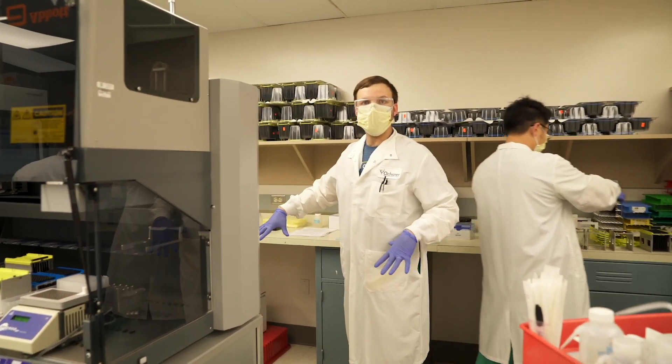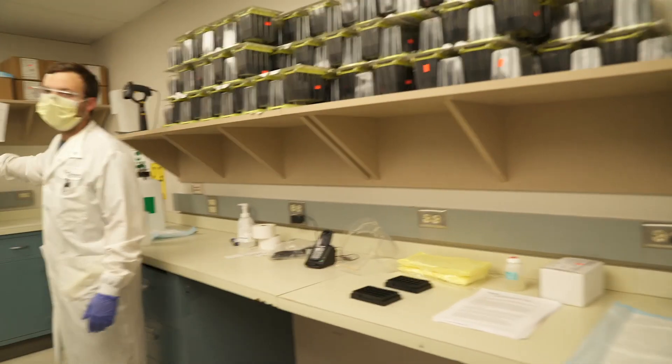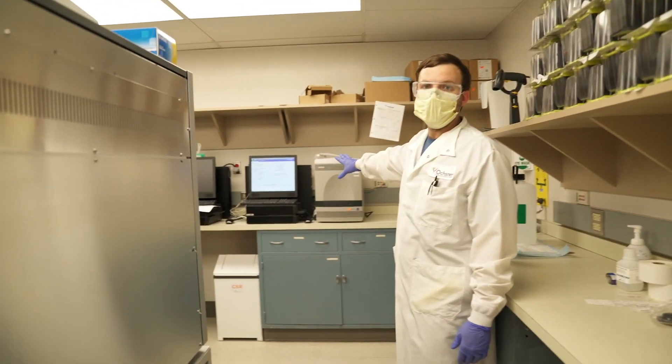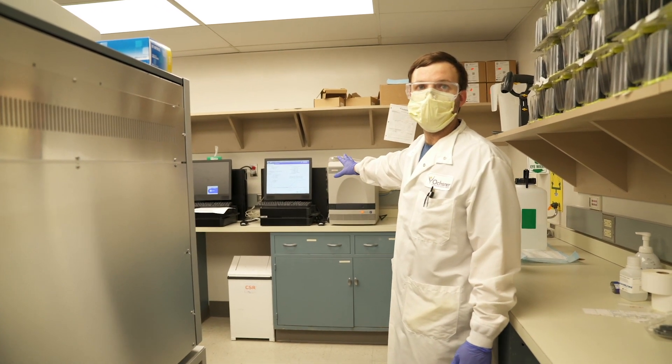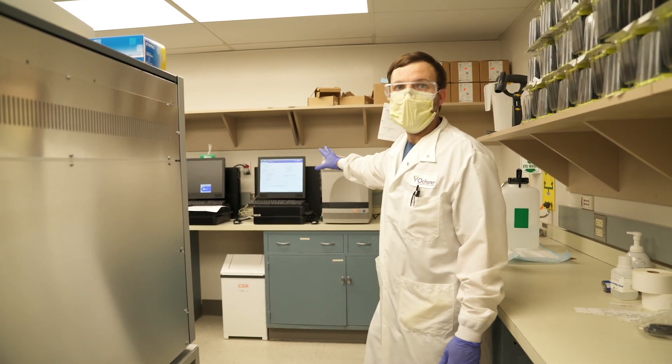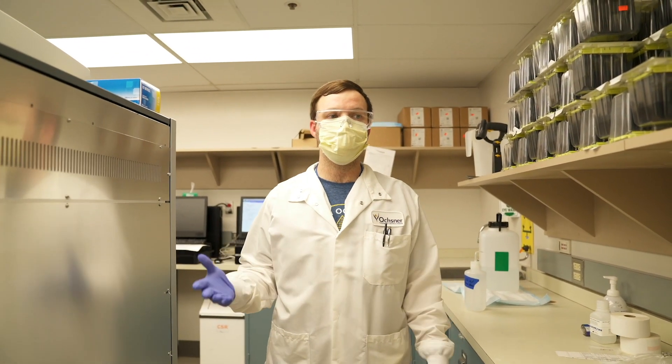This area is a much cleaner area so I'm not going to let you step too far, but these devices over here are our real-time thermocyclers. This is where real-time PCR is occurring, and this is where we get the detected or not detected result for this particular virus.